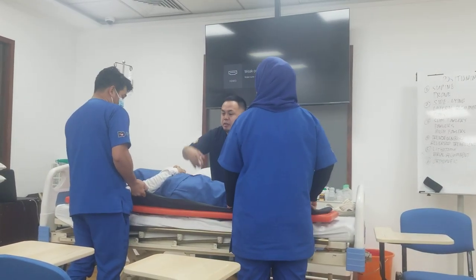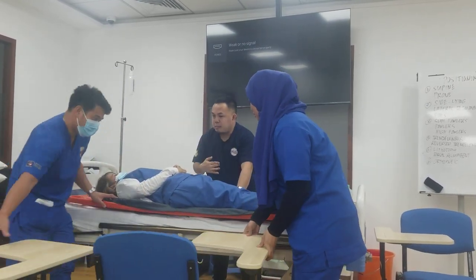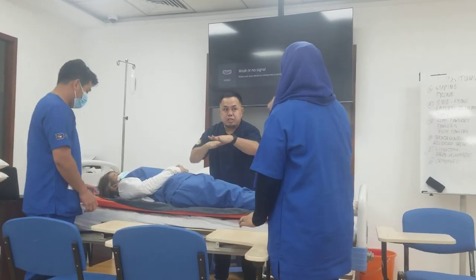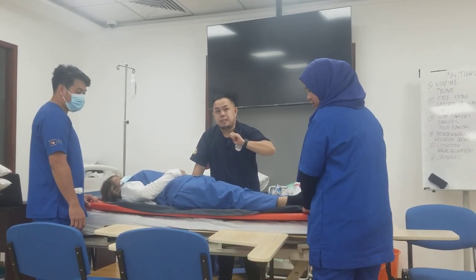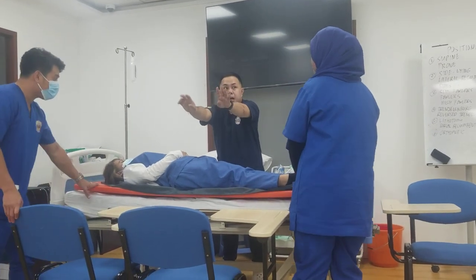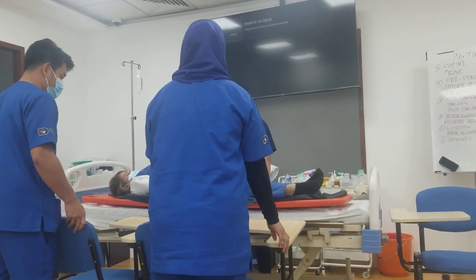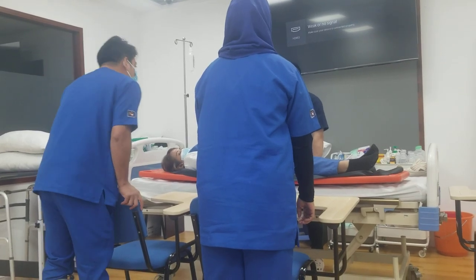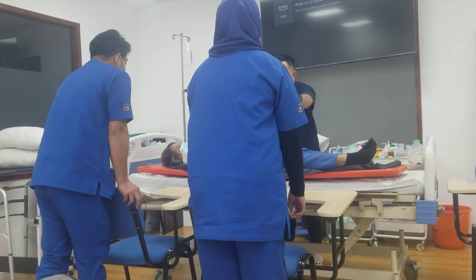Ask your colleagues to move the stretcher bed towards the patient's bed. Make sure it is the same height, then lock the wheels. Have one colleague stand on the other side of the stretcher to hold the board. You are now sliding the board with the patient towards the stretcher bed.